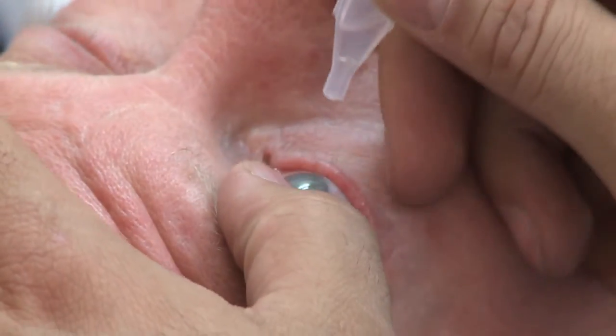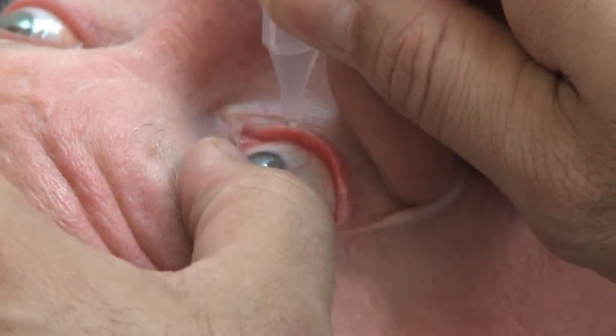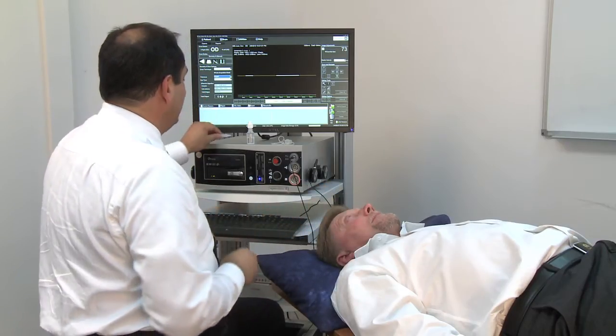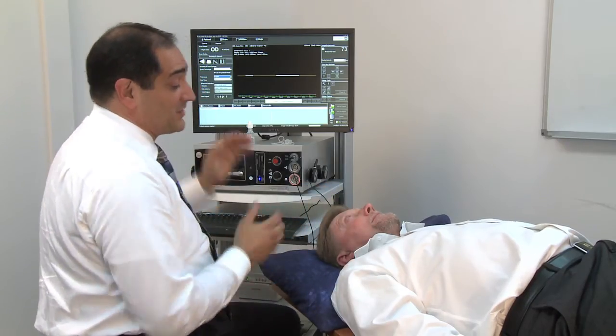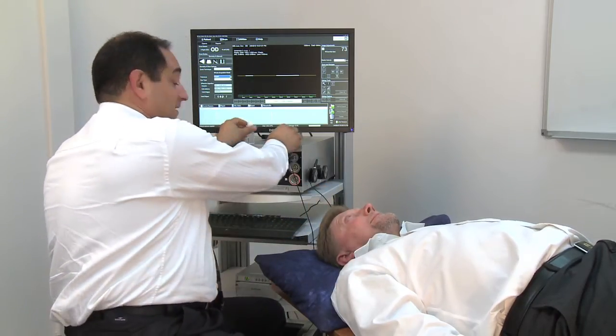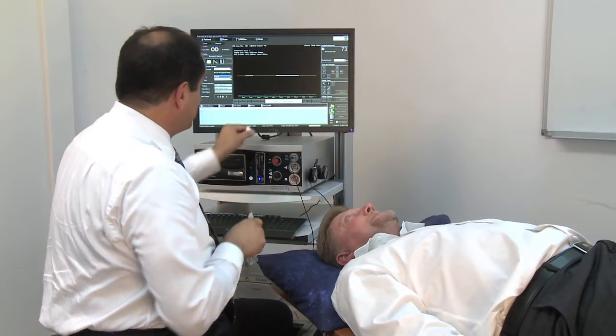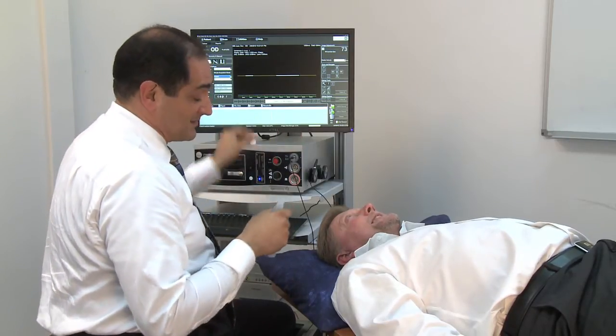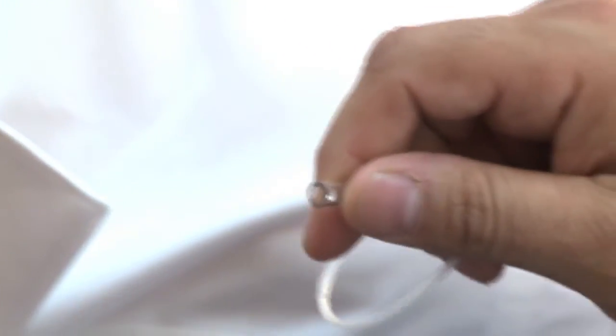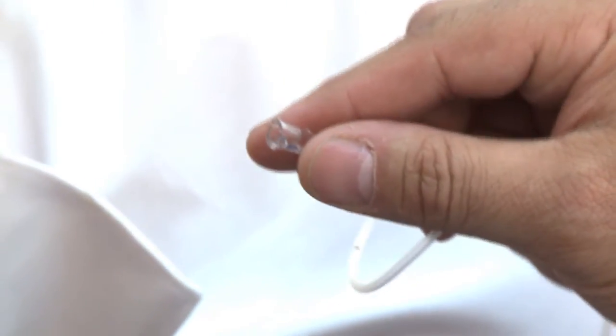Place a couple of drops of anesthetic on the patient's eye. Remove the small plastic stopper at the end of the tubing on the immersion shell and connect the tubing to the BSS bottle.